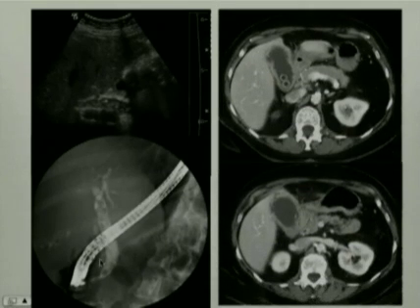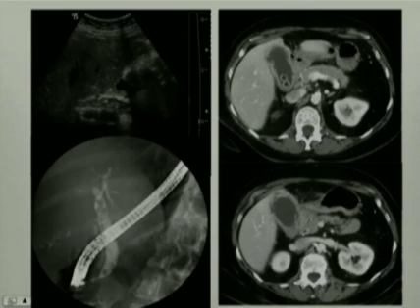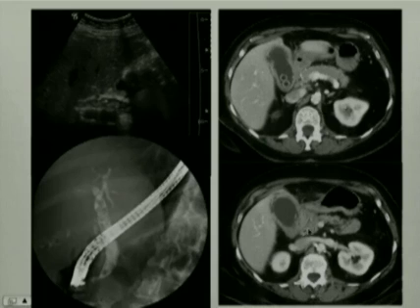The patient also underwent CT, which demonstrates a very inflamed gallbladder, some gallstones, and some common bile duct stones, which are not very well seen on these two images.